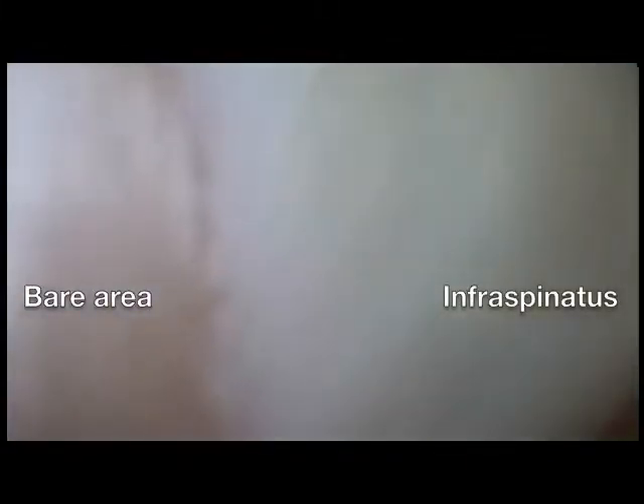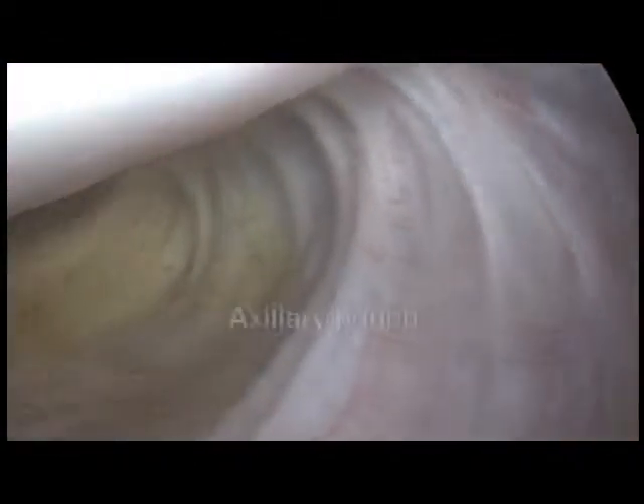More posteriorly, the tendons of the rotator cuff — the supraspinatus and more posteriorly the infraspinatus — the bare area of the humeral head, and the axillary pouch at the inferior aspect of the joint. The posterior glenoid will lead us up to the superior labrum.